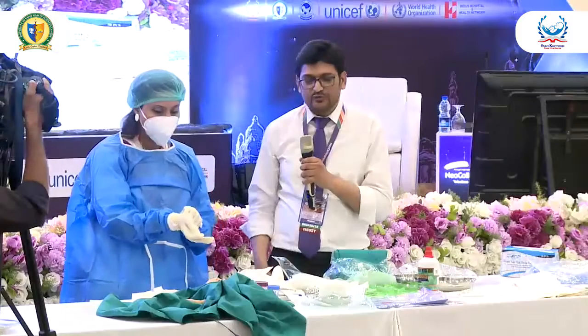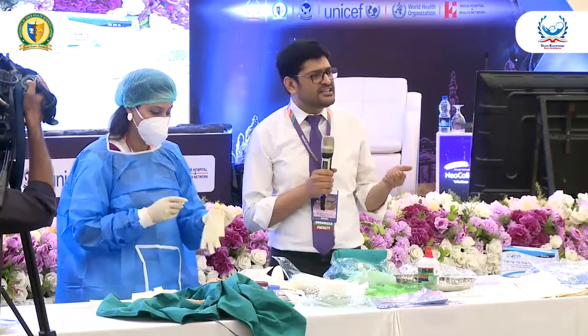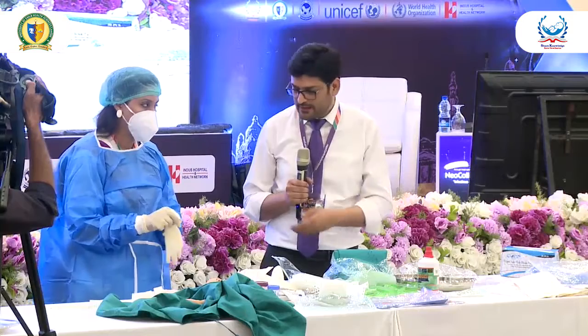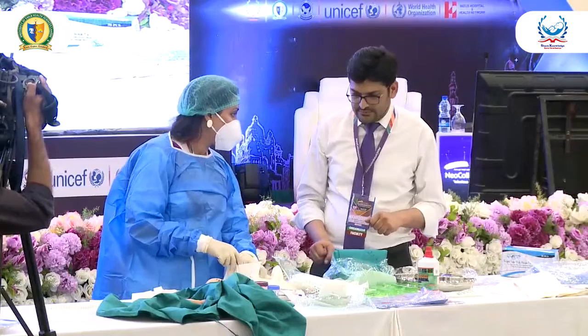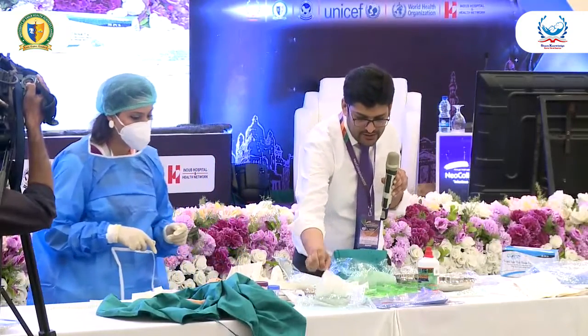Now we'll remove the first layer of our gloves, which have already been a bit contaminated. Apply the tourniquet.